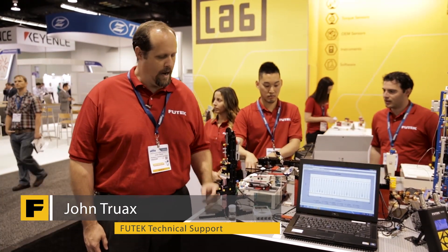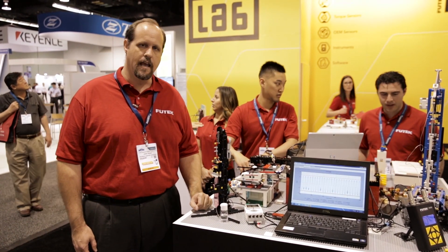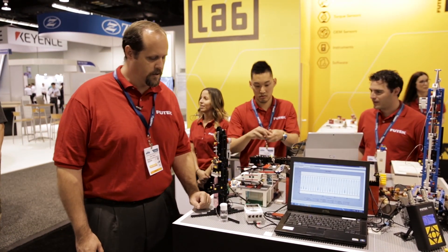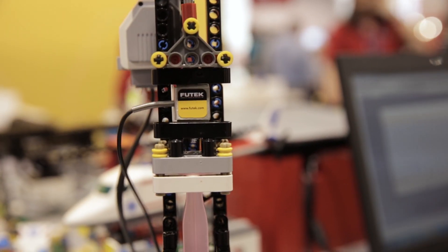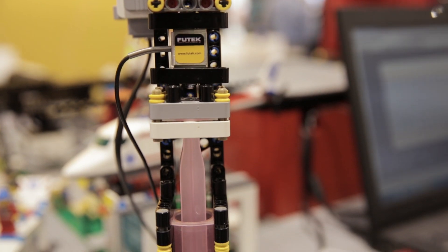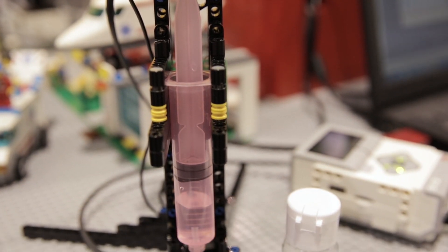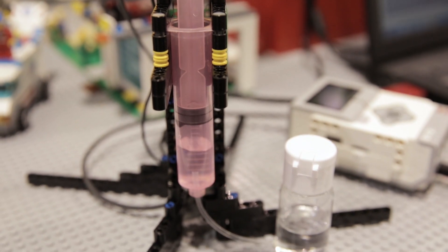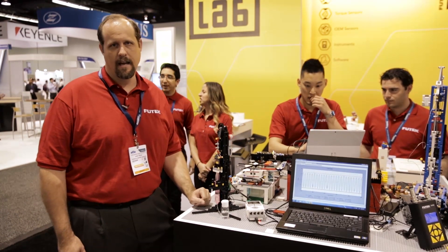What we have here is a demonstration of an infusion pump. We're utilizing our miniature line of load cells, the LSB200, and it's measuring the force on the syringe. Utilizing the load cell in this type of application is an advantage because we can ensure we're applying the same force on the syringe each time — meaning we're going to pull the same volume of liquid into the syringe each time.